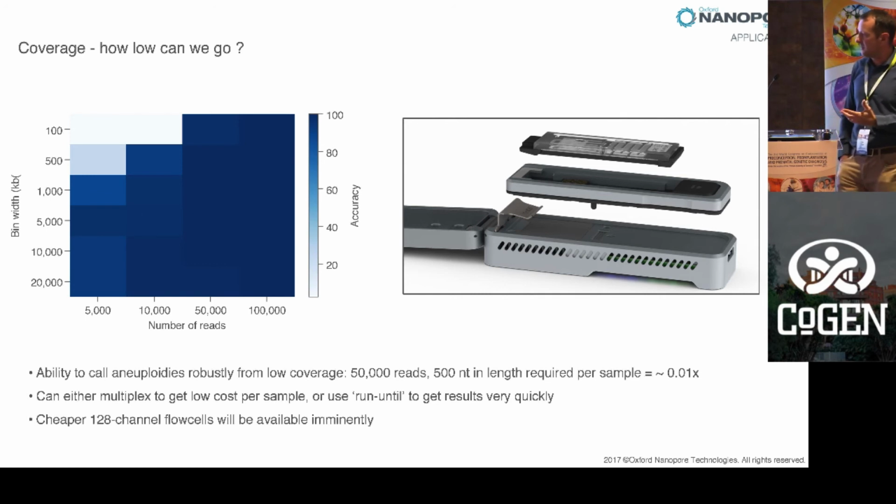If you do the maths, that tells you that you would, in theory, be able to fit something like 600 samples together on a single run, if you were to label each one uniquely. But I'm guessing that for a clinical assay, no one's going to want to do that, really, because there's a slight chance of getting the samples mixed up.